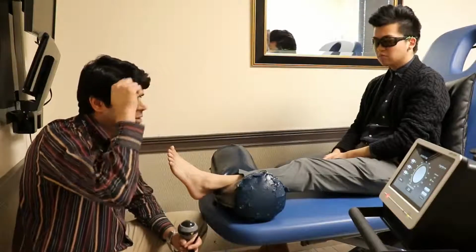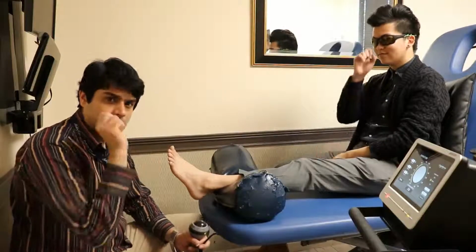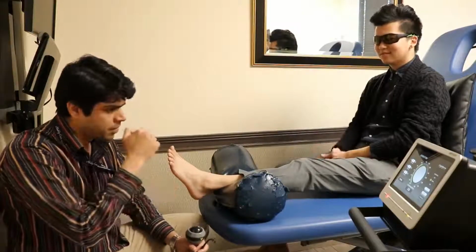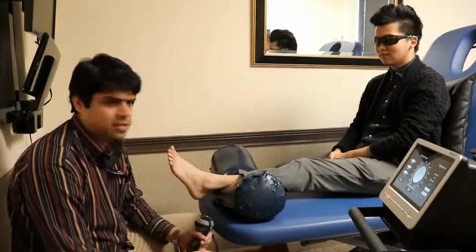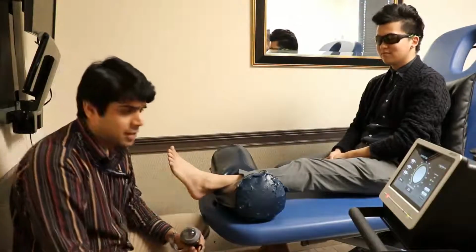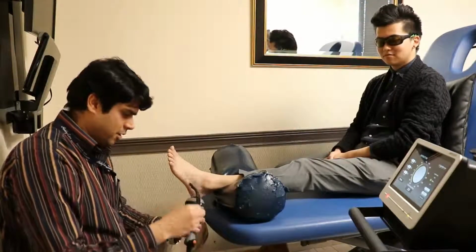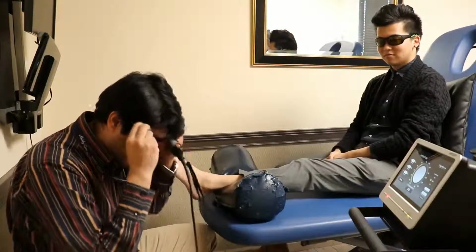actually much more effective. So Anthony's been complaining of foot pain for the last couple of days, and we're just going to use it on his foot and see if he feels any better with it. He was actually just telling me before we started filming, you had burning pain in your foot yesterday? Burning pain in his foot yesterday, so I'm just gonna do the whole setup real quick. It's gonna take like 30 seconds to set it up.